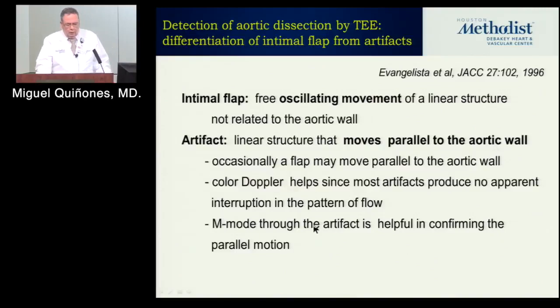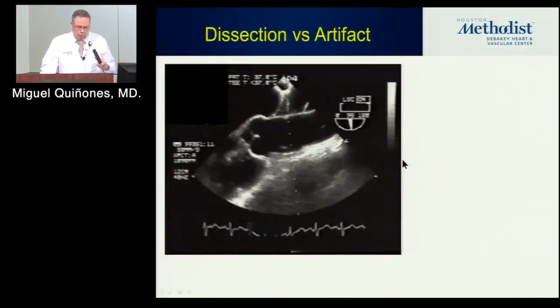So this was, I think, one of the best papers that really put that to rest. This was from a group in Barcelona. I know him. He's a great guy, very, very smart. And they had this publication in JACC basically 20 years ago. And they suggested that the best way to look at this artifact is with M-mode.